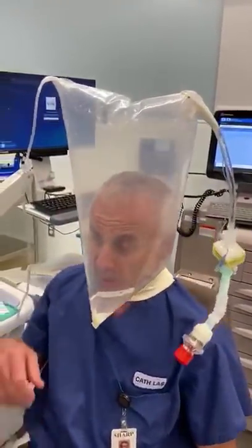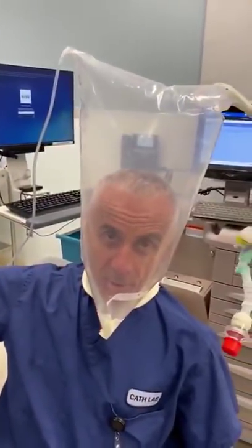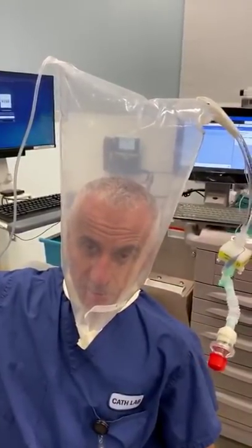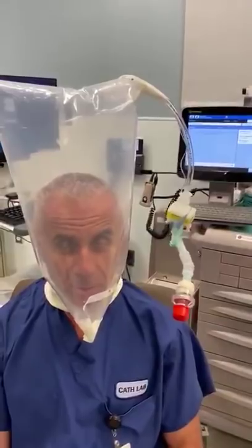Very simple, very efficient. A lot of patients with pneumonia don't need to be on the ventilator right away, but especially if there is a shortage of supplies, it's a very simple and efficient way to create PEEP and a 100% oxygen environment.